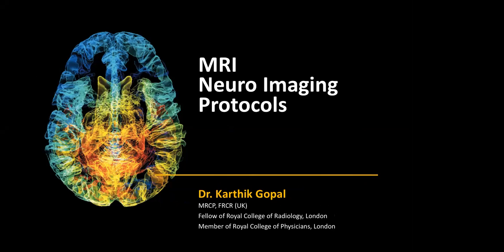This goes away from trauma imaging. Very rarely do we do MR for trauma. I mean, there are one or two indications which we do. Certainly trauma, when we're talking about diffuse axonal injury, is one indication that comes to my mind. Post CT, we do MRI just to prove the point. But generally here I'm talking about your routine neuroimaging on a day-to-day basis.